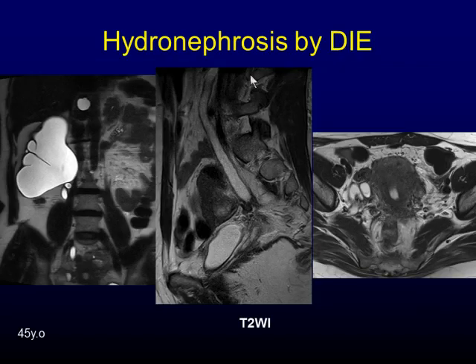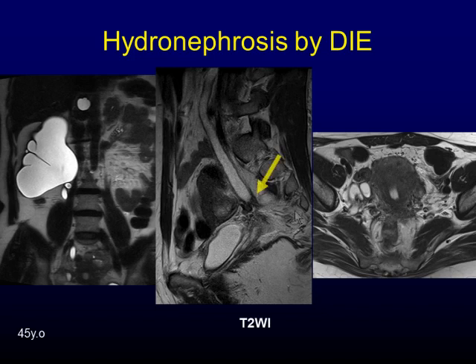The ureter is the second most frequently involved organ in the urinary tract. This patient had bilateral endometriosis. On coronal and sagittal T2-weighted image, right renal pelvis dilatation and dilatation of the ureter is found. At the bottom of the dilated ureter, an irregular hypointense region is found. On axial image, that region is clarified as part of an irregularly thickened uterosacral ligament with traction of the rectal wall.